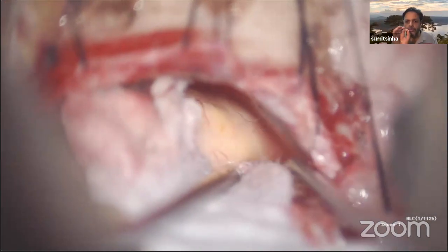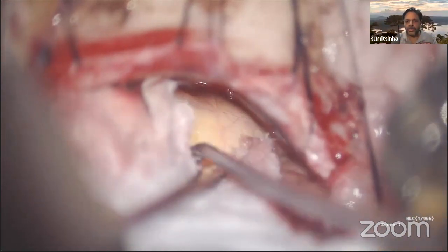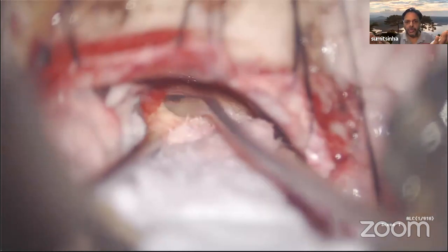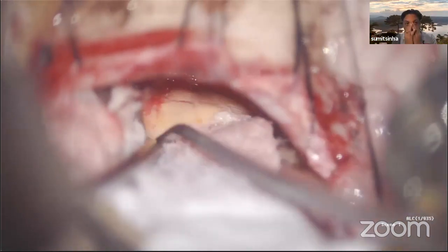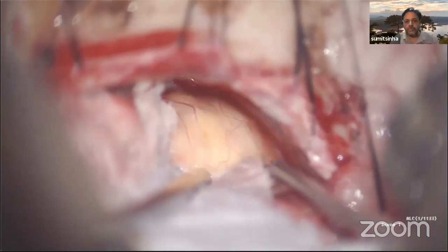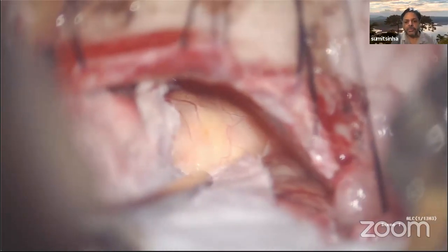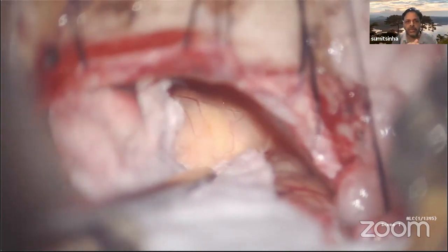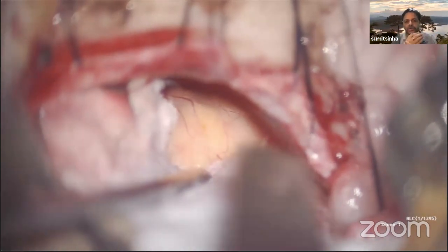And my whole purpose is to dissect the arachnoid membranes from the tumor capsule away towards the cerebellar or the brainstem surface. And once I do that, I will be left with only tumor capsule in front of me. So this is the first step on the tumor that you accomplish. And this has to be done with great care. No bipolar, absolutely no bipolar. Bipolar is contraindicated in this surgery, because it destroys the planes.